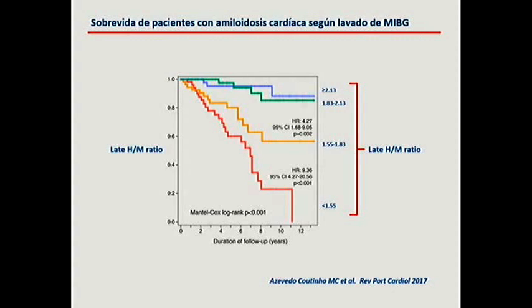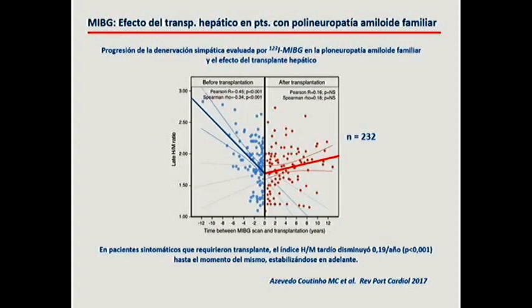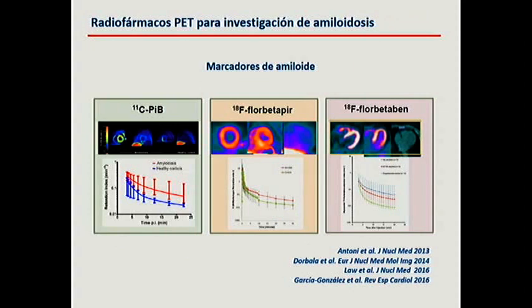See the difference in survival rate according to the heart to mediastinum relation. This is before and after the liver transplant, the MIBG uptake and the heart mediastinum relation.